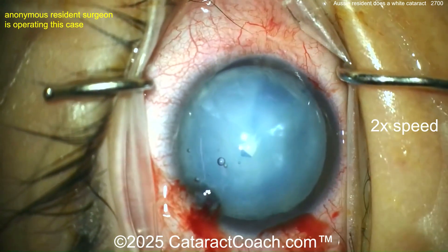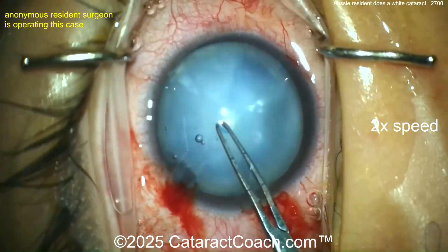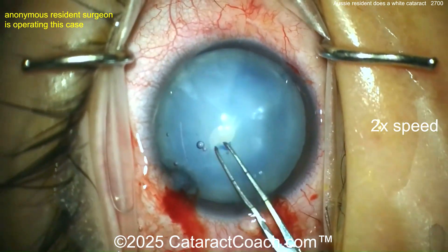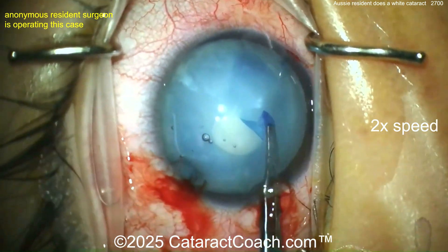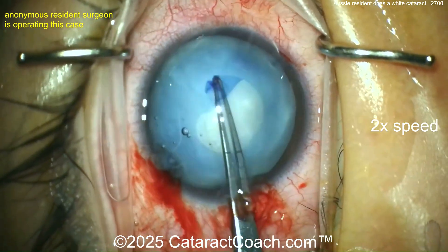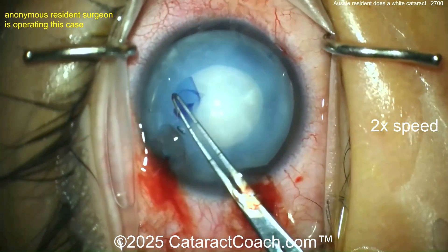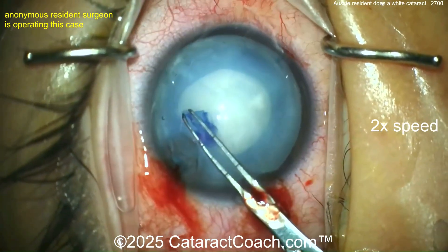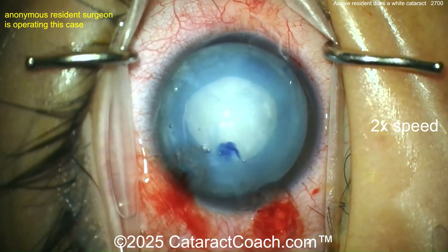Now there's the rocking of the nucleus — looking good. You can get a good rhexis done. Nice forceps marked off at two and a half to five millimeters — getting this rhexis completed. Measuring it out, getting a good idea. It's maybe a big myopic eye because this eye looks so large; the corneal white-to-white looks pretty big. That's obviously a five-millimeter rhexis, measured out. Great skills here. Running out a little bit — I'd bring that in a little tighter. Nice looking rhexis.